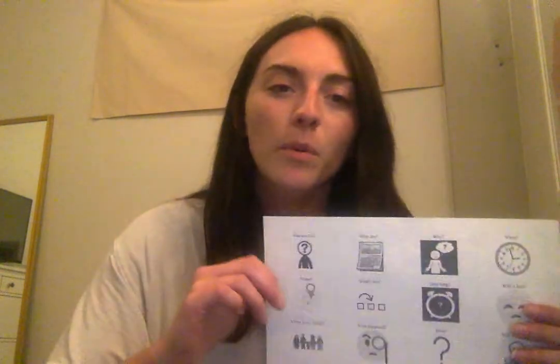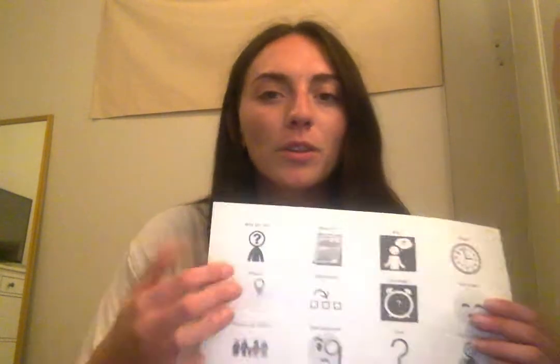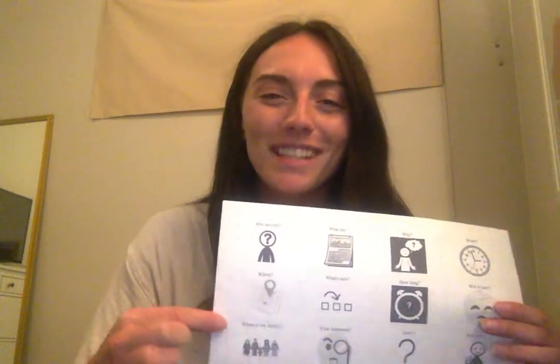Hi, my name is Hannah Erba and I will be showing you today how to use a Low-Tech AAC board with questions on it. A Low-Tech AAC device is a device that requires no battery that allows an individual to communicate with others. This board I'm going to show you today was created with the intent of allowing an individual who's staying in the hospital to point to questions that they may have during their stay.